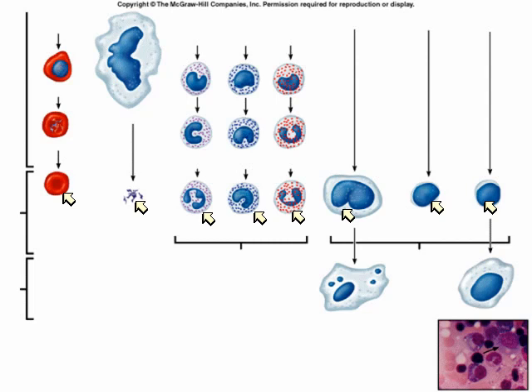So if you were having an allergic reaction, you can see on that table your eosinophil count is going to be higher than 3%. If you were fighting a bacterial infection, your neutrophil count would be elevated. Or if you're under stress, your neutrophil count would be elevated. So this would give the physician an indication of what you're fighting, so he would know what drugs to prescribe and how to further treat you. Our goal for this lab exercise is simply to look at individual white blood cells and determine what type they are.